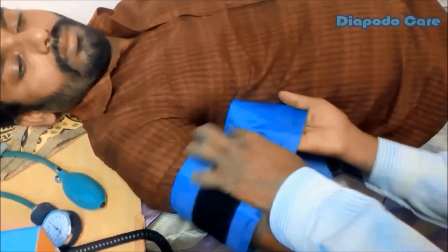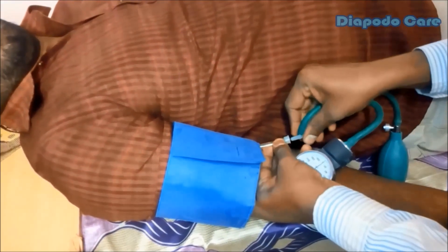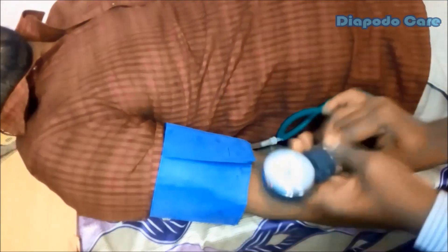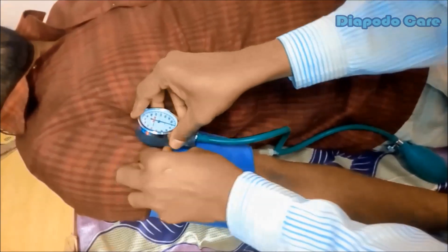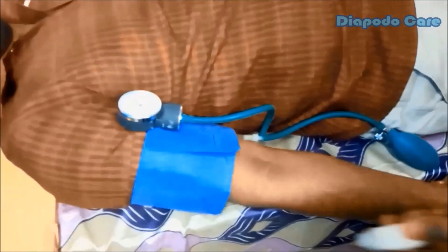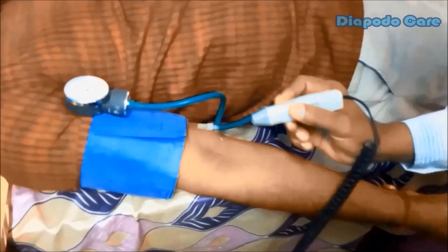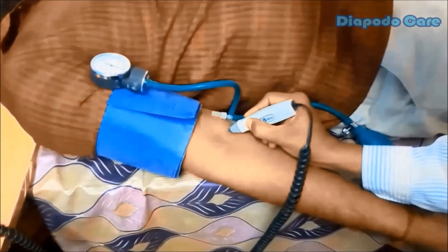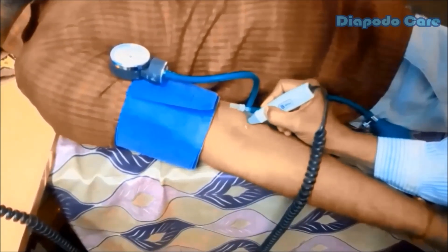During screening, the patient should be in the supine position. For tracing the brachial artery for recording and BP measurement, the cuff should be tied at the arm as shown in the video. After tying the cuff, connect the BP dial and cuff bulb to the pressure cuff. Apply a small amount of ultrasound gel to avoid external noise while tracing. Place the ultrasound probe on the brachial artery and hold it at approximately 45 degrees in the opposite direction of blood flow. After hearing a clear rhythmic blood flow sound, you will see the waveform on the software screen.